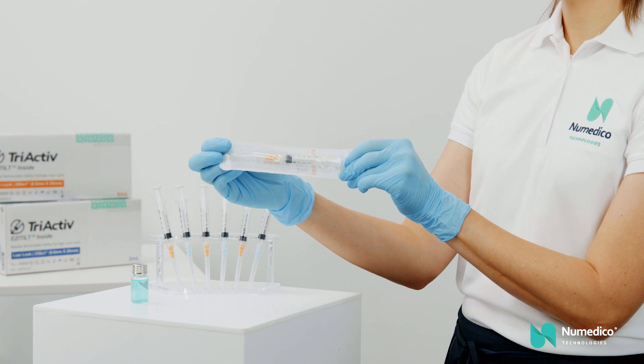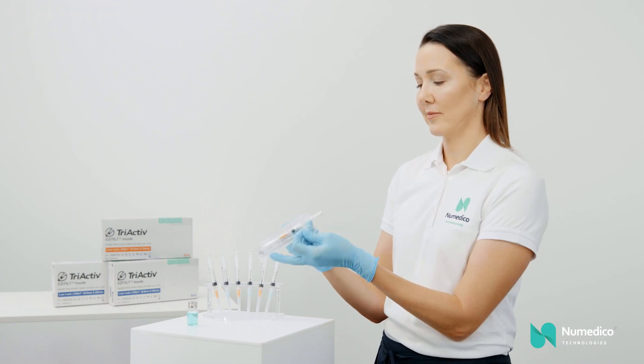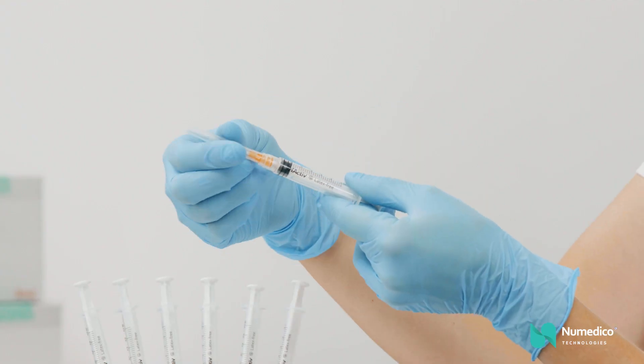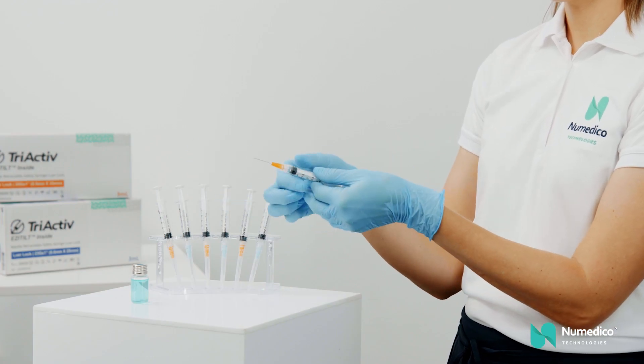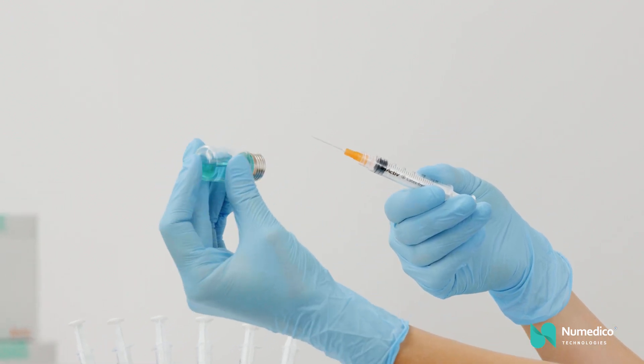It is easy to operate with minimal or no training required, and provides the user with a simple four-step process. First, make sure the needle is fixed tight. At this stage, do not fully compress the plunger to avoid activating the needle retraction mechanism.